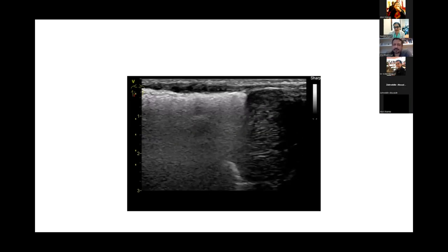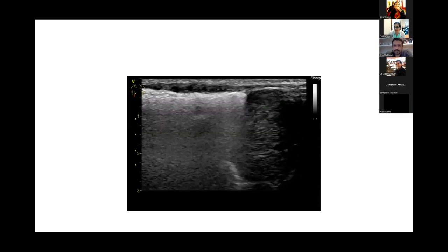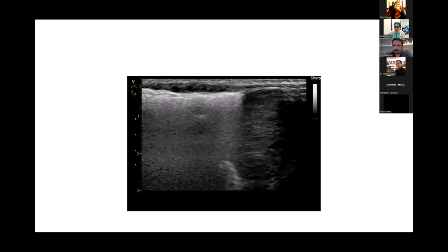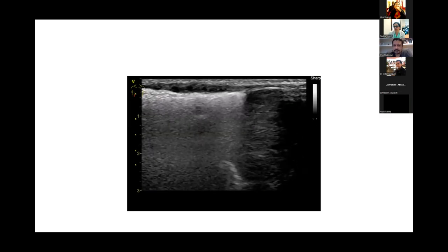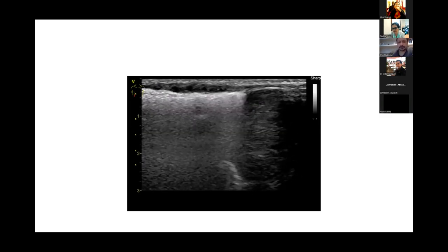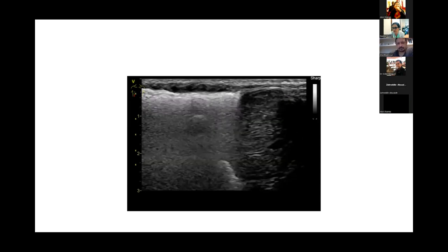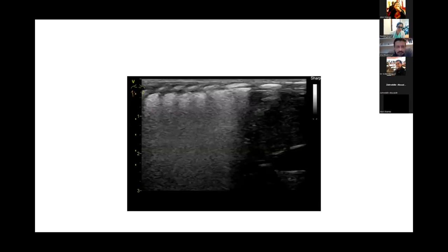If there's nothing on the pleural line, then it doesn't make sense because we're not really seeing the lung. The second thing is, if it were PIE, in addition to the interstitial changes, you would have areas that could almost look like pneumothorax because you have smaller areas, but more localized depending on how large it is. You would have maybe areas with less lung sliding, but more distended areas. And this is not the case, except for this round thing here in the middle that we don't really know what it is. Maybe somewhere else there is, but you would expect to see more air. There has to be air in the lung somewhere because of the emphysema, right? Yes. Great.